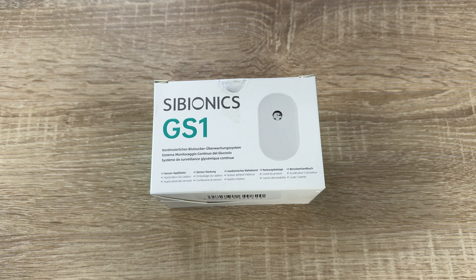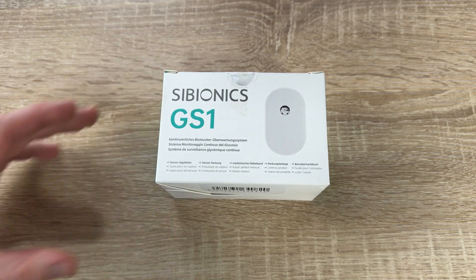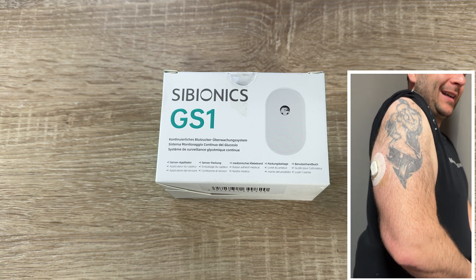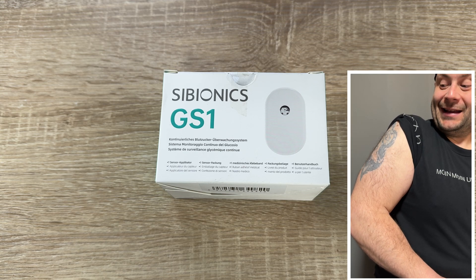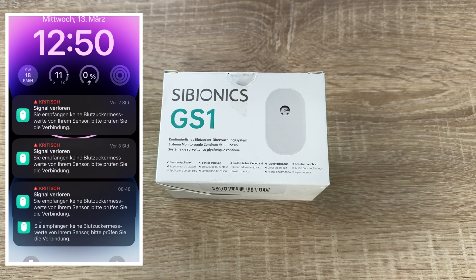Hello! Today I'm going to show you an awesome unboxing video. Let me introduce you to the Sibionics GS1 — this is a continuous glucose monitoring system, a CGM.